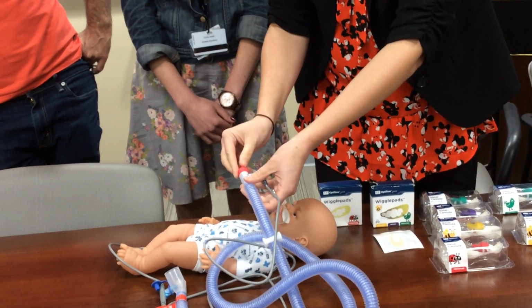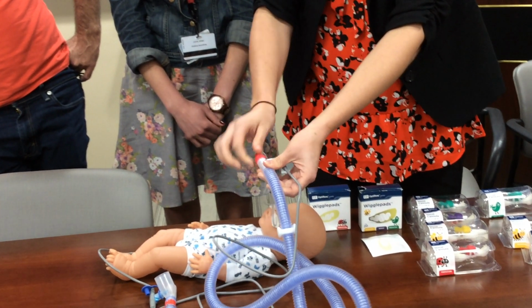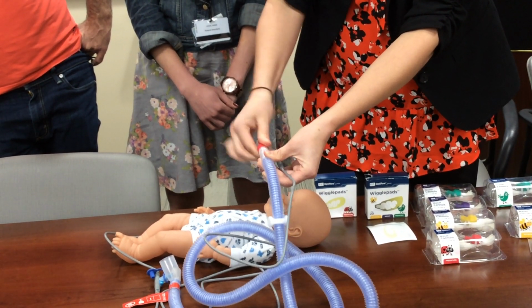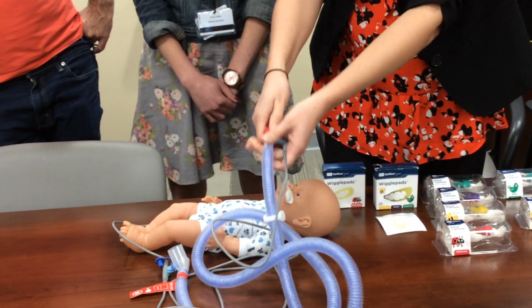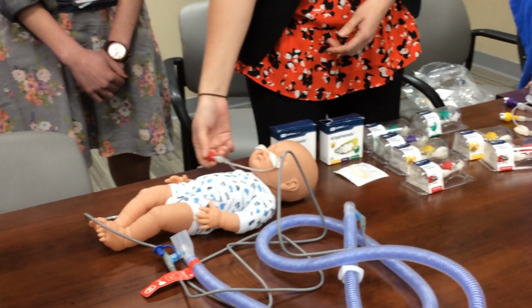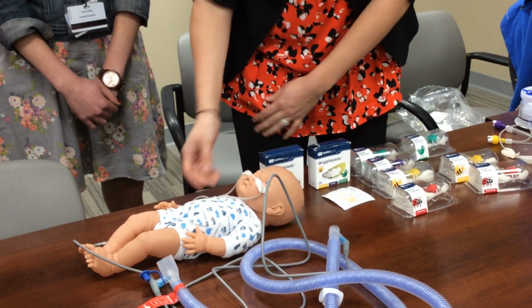The cannula clicks into the circuit and you hear a nice secure click. There's a swivel at this little part right here, so you can twist that around. If the cannula is tangled, you can untangle it without having to break the circuit. The cannula is pretty flexible, so you can lay it over the front of the patient, or come down to the side and use this little piece to take out the slack.